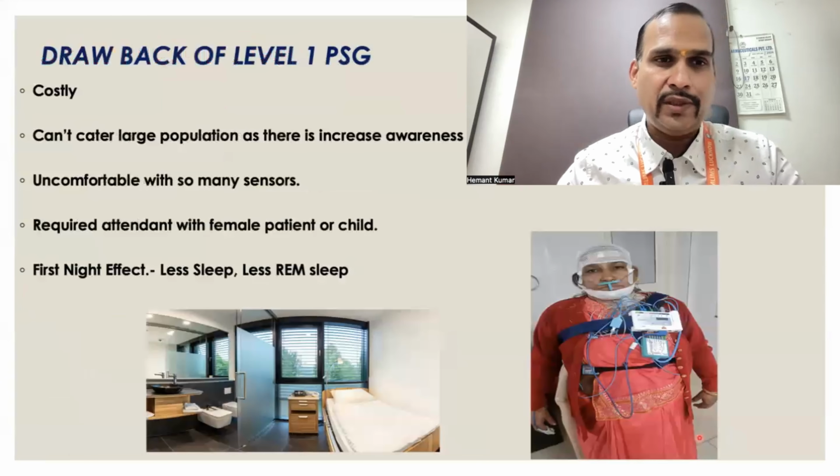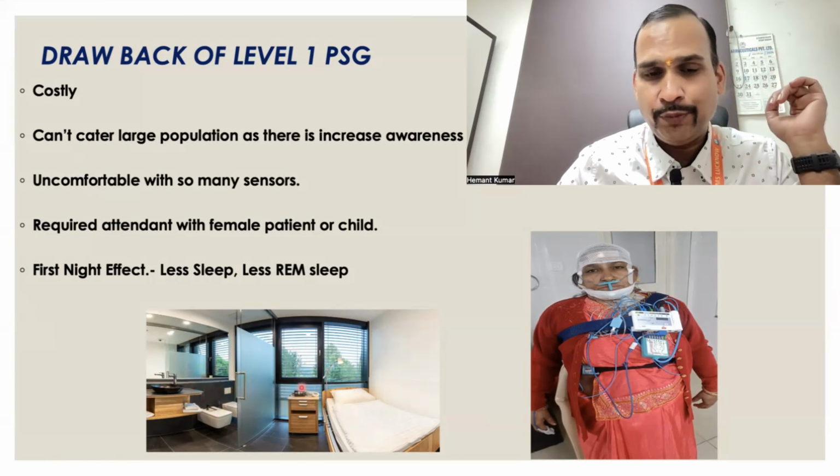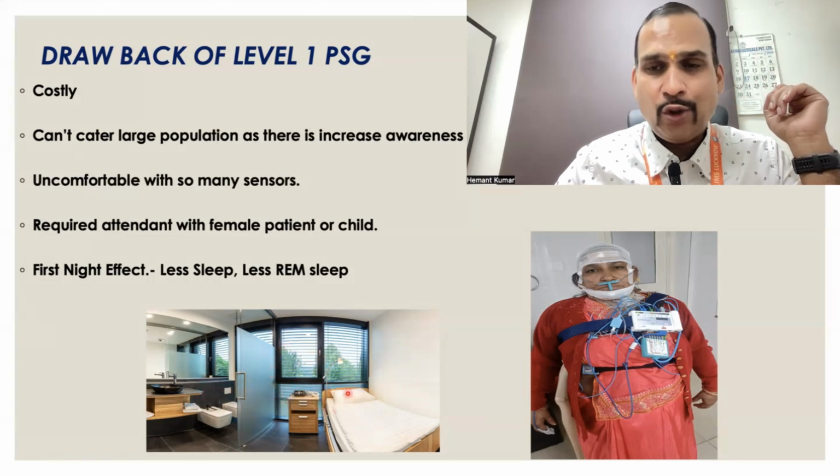But there are drawbacks. Though it is the gold standard sleep study, level 1 or type 1, there are drawbacks also. It is costly because we require this type of setup for a sleep study. This is an American Standard Sleep Center. The patient should have a ventilated bed, a well aerated room, and an attached latrine and bathroom. So this is very costly.